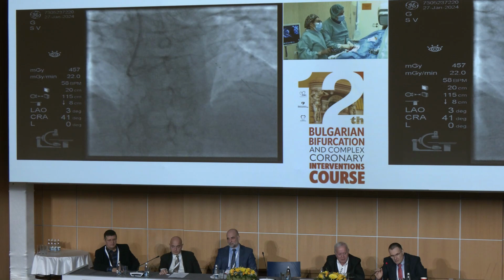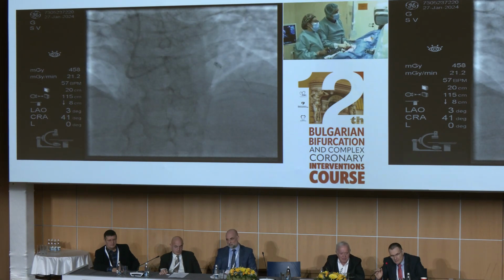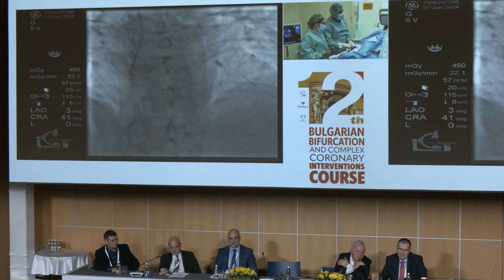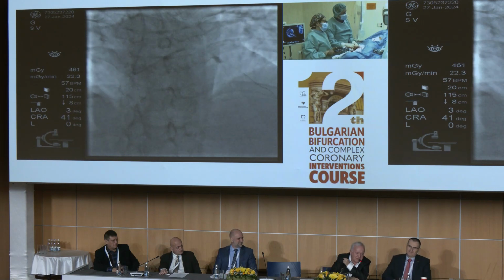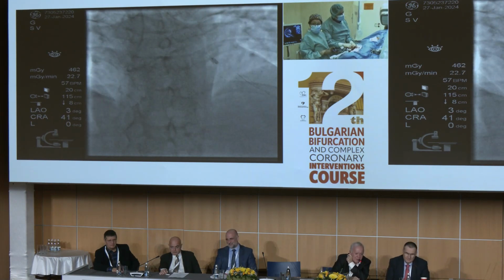This is exactly it. It is really cylindrical, and you should be very precise in positioning. Don't go to 23 atmospheres. This is crazy. So what you can do here is a small puff. Press.